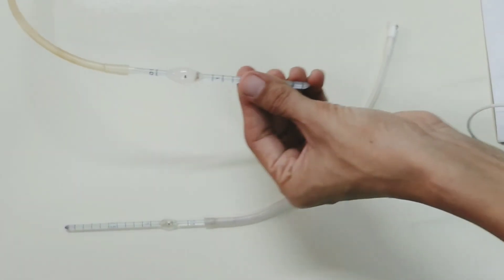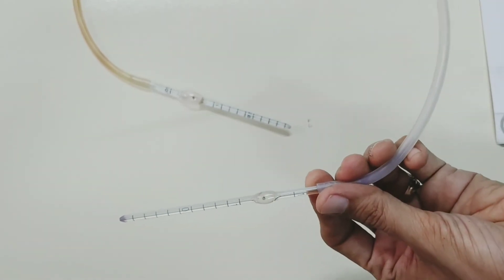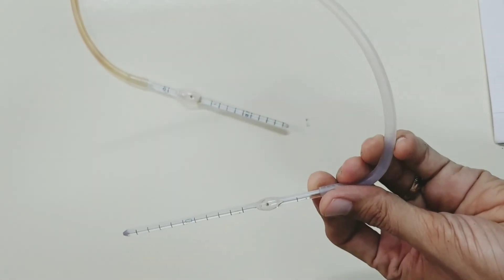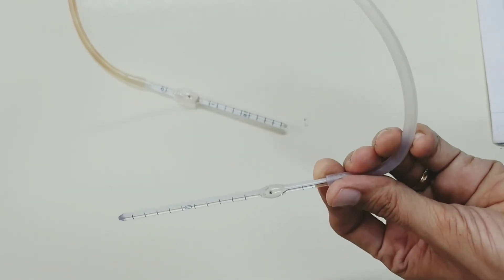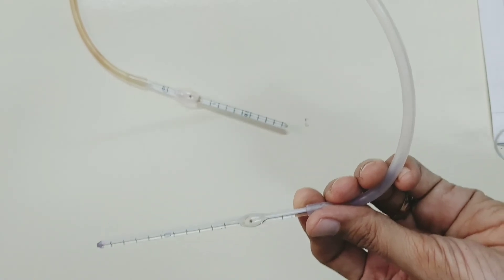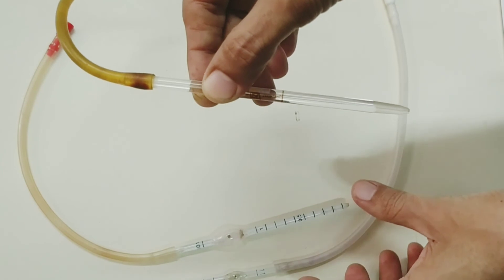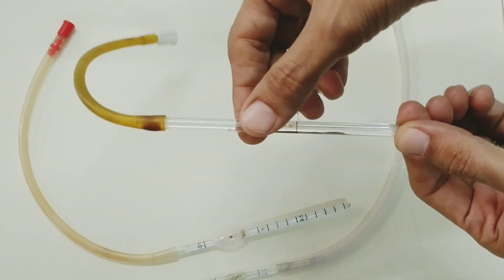WBC pipette is used for counting RBC in case of severe anemia. It is also used for platelet count, sperm count, and bacteria. Third variety of pipette that is not in the hemocytometer but we are using it, is the hemoglobin pipette.